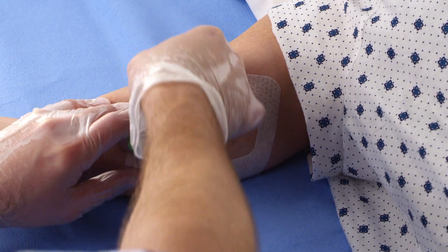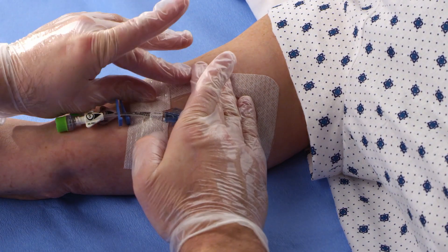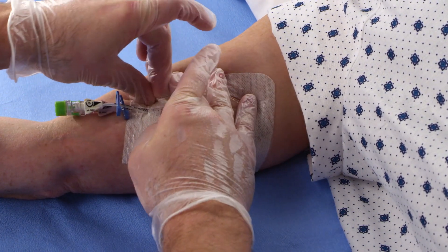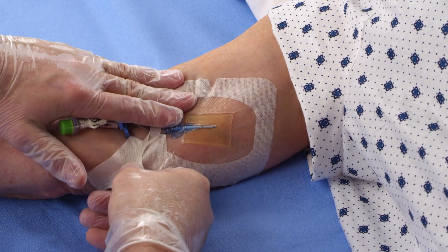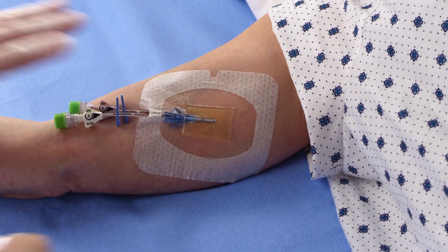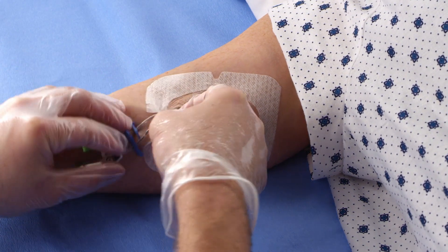Remove the dressing in the direction from the extension tubing or needleless connectors toward the catheter insertion site. Gently grasp an edge of the dressing and slowly peel the dressing from the skin, supporting the skin and catheter to minimize dislodgement.